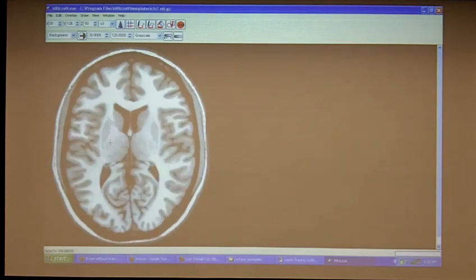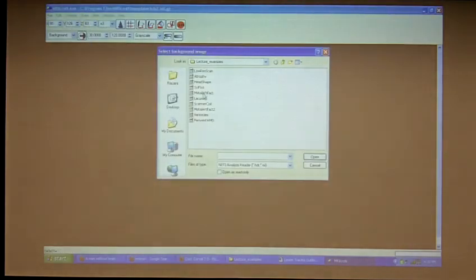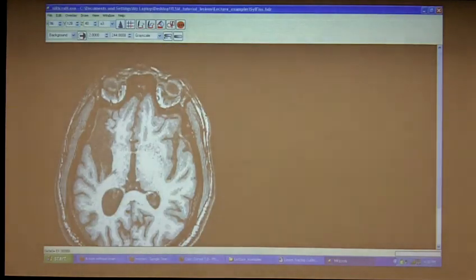Now, when you have damage, sometimes this will sort of open up and look a lot bigger than it is. Sylvian Fissure, here we go. So the question, you can see this person has a lesion, here-ish. But you can see on the side here, this is Sylvian Fissure. This is normal. It's got this ribbon of gray matter around it, and it's normal. It's jutting in. And here, it's jutting in. And then on this side, there's gray matter. But here, this is what you should be looking for, these cuts. It looks like it's just cut out, or scooped out with a spoon, right? So that edge is clearly lesion.